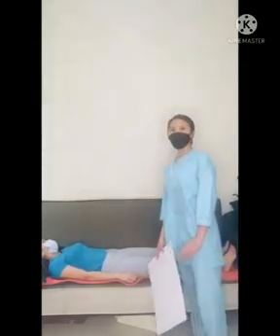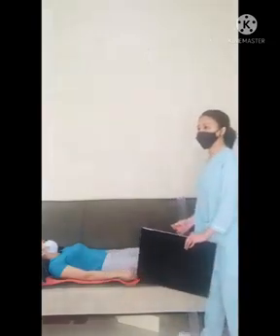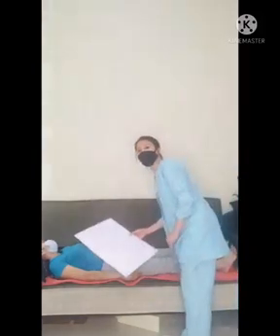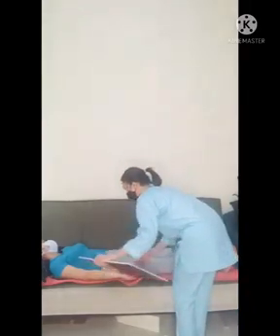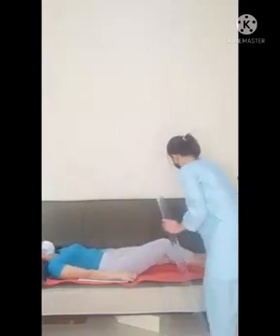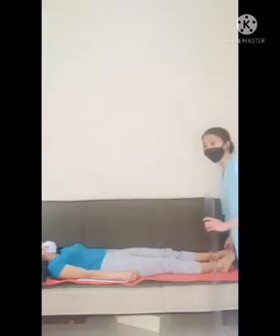So, the patient's pelvis is adjusted so that there is no rotation. The foot is rotated internally 15 to 20 degrees to place the femoral neck parallel to the IR. We need to put our image receptor, which is 14 by 17 inches. Sige po, the foot of our patient is rotated internally, like this, 15 to 20 degrees.